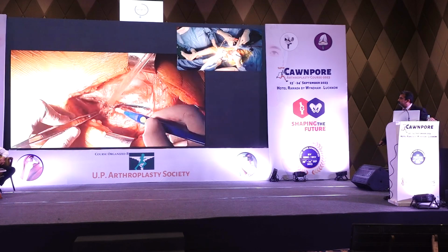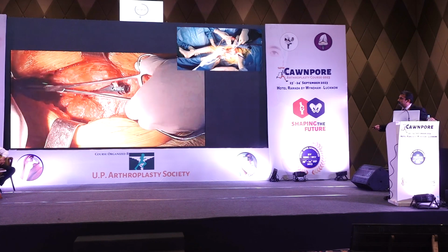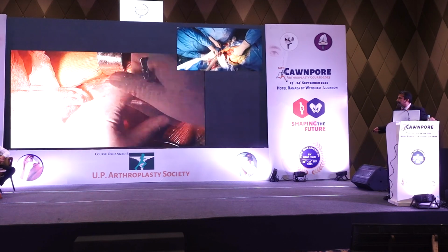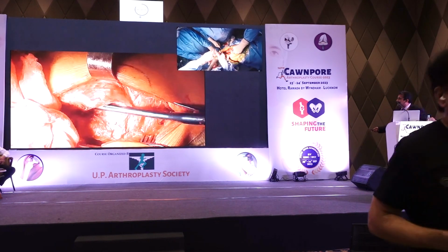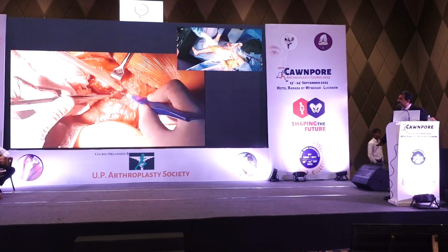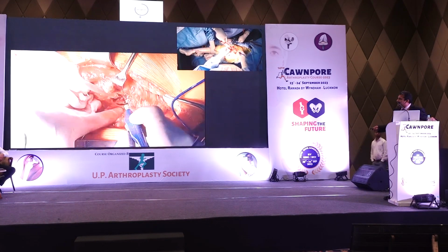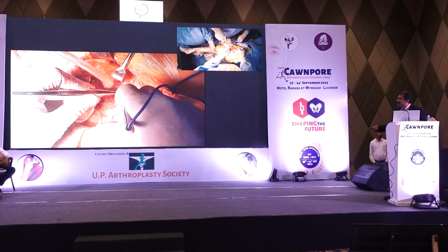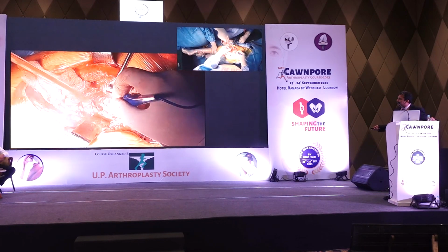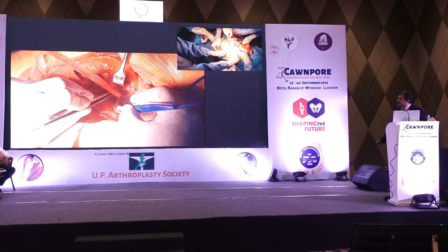As well, initially itself. A lot of surgeons forget to remove the screws. I have seen surgeons shattering the femur while removing a PFN before a total hip arthroplasty. You need to have the universal stem removal set available for the nail to be removed. And then you must locate your acetabulum. There will be a lot of fibrosis because of neglect and previous surgeries. Once you have a feel of the bone there, you will probably be able to extract the femoral head and reach your acetabulum easily. It can be challenging sometimes if the head is absorbed.